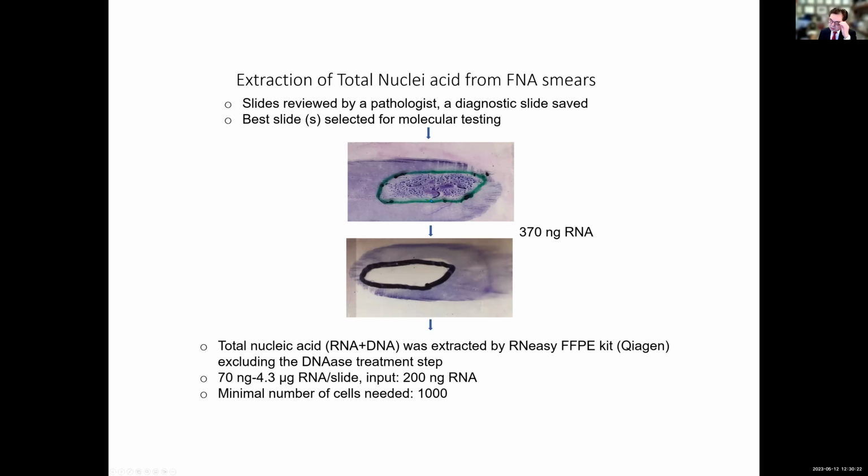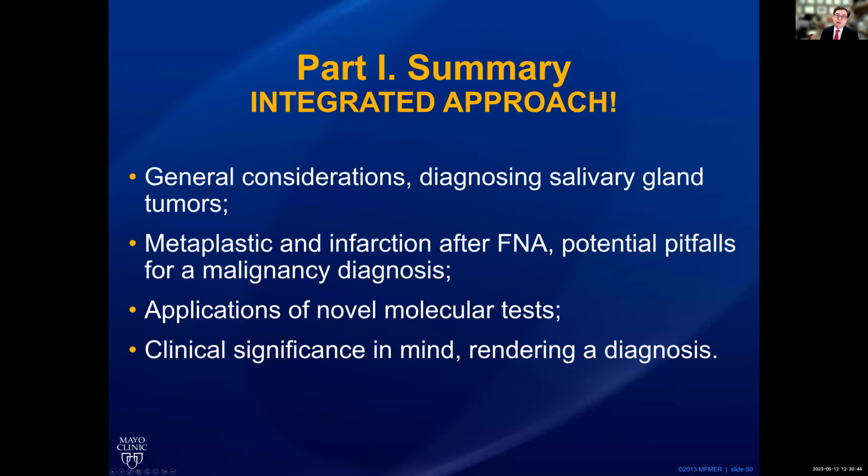You mean on cytology, if you see something there very suspicious, as we know, cytology again is a screening technology. Sometimes they don't have the structure, the growth pattern of the tissue or the lesion, and you can do a FISH and you carve them out and you do this. We just mentioned the NGS panel, and it's being validated. It is a very useful technology. This is brand new.